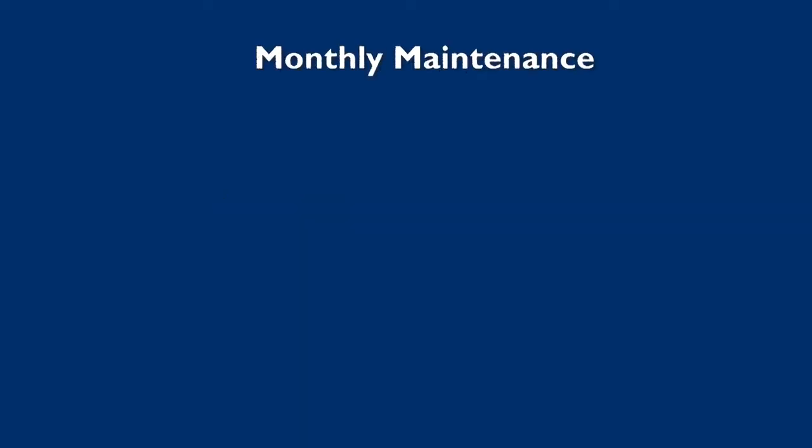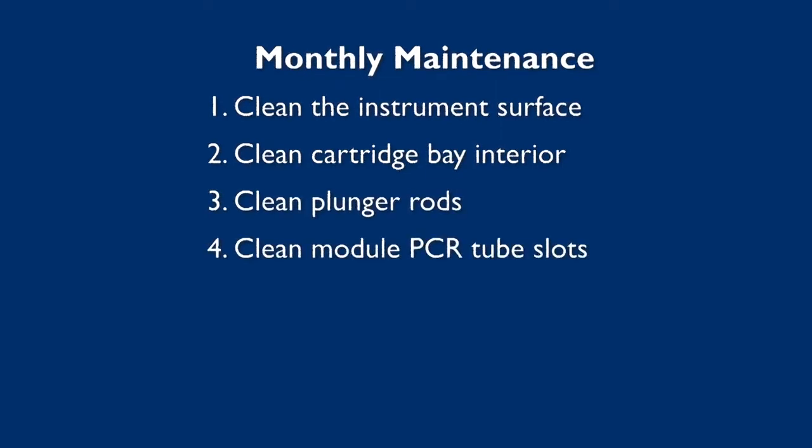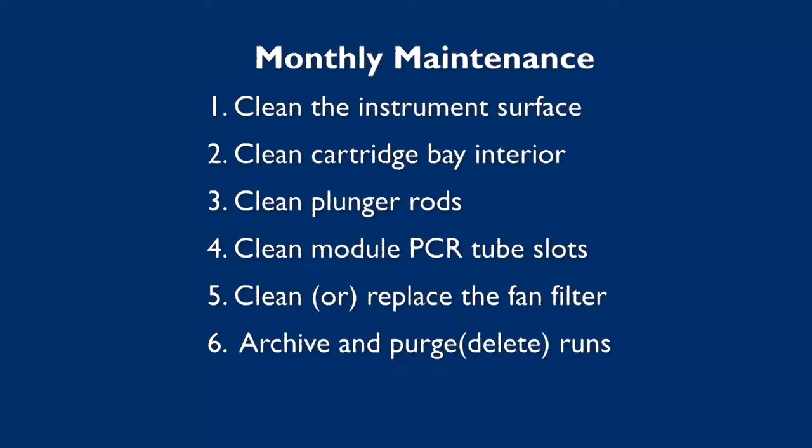For monthly maintenance, the procedures are: 1. Clean the instrument surface. 2. Clean cartridge bay interior. 3. Clean plunger rods. 4. Clean module PCR tube slots. 5. Clean or replace the fan filter. 6. Archive and purge, delete, run.